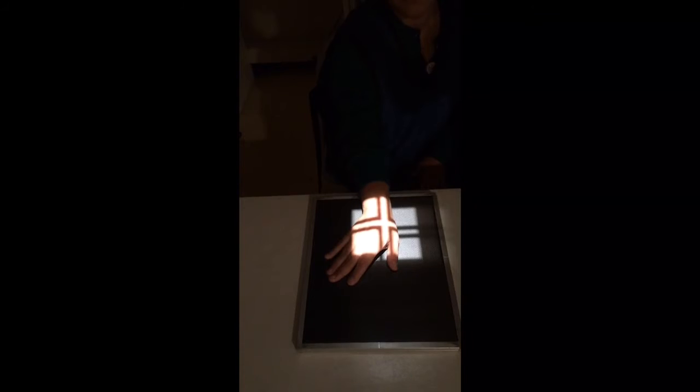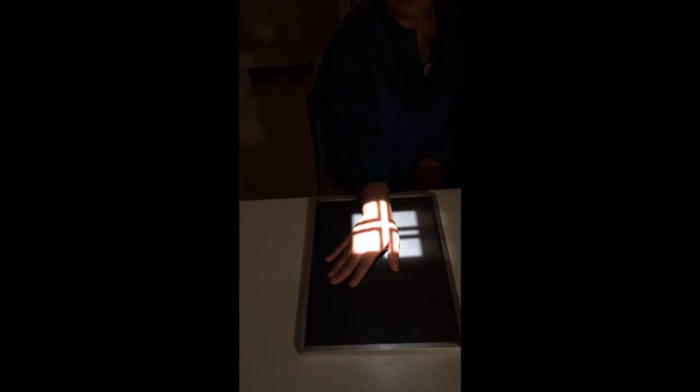We're going to have the patient go ahead and deviate their hand this way as much as they can. It all depends on patient comfort. So we'll go ahead and direct it right there towards the scaphoid. We don't want to collimate too much, but we can close it out this way. And with that exam, we can go ahead and see any injury to the scaphoid or any of the mid-carpals, but specifically for the scaphoid.